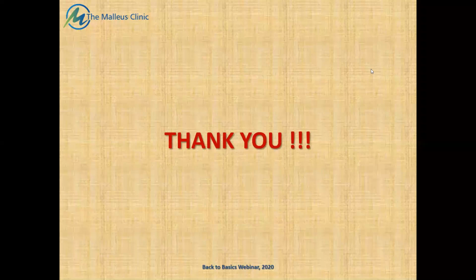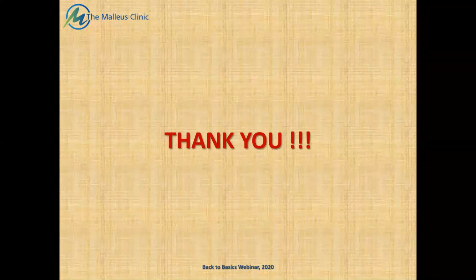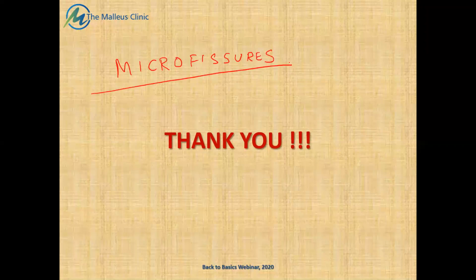Yes, sir. First part from me. What about the CT negative? CT temporal bone can miss the perilymphatic fistula, or another way, could we have a perilymphatic fistula with a normal CT temporal bone? So this is the first part of the question. The second part comes from Dr. Ines: do you think that the new gadolinium-based technique used for Meniere's disease could be useful in those cases with a clinical picture of perilymphatic fistula and a negative CT temporal bone?